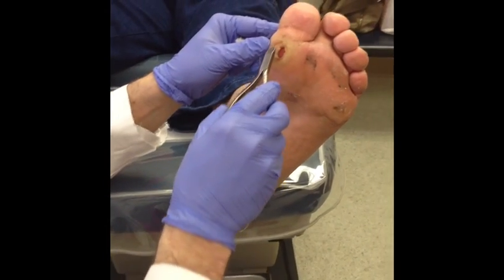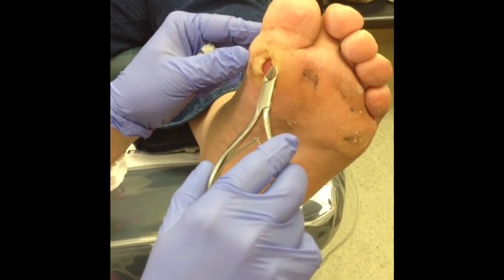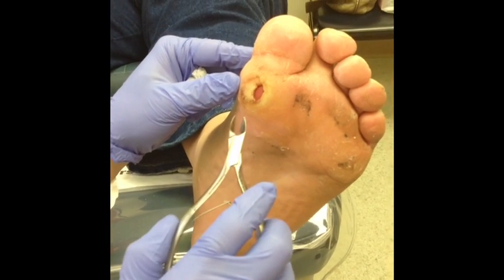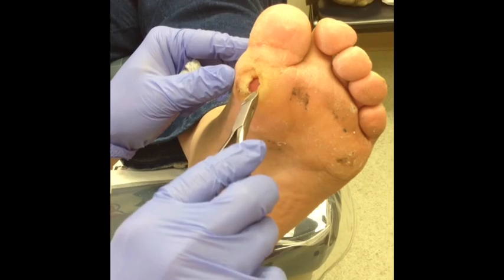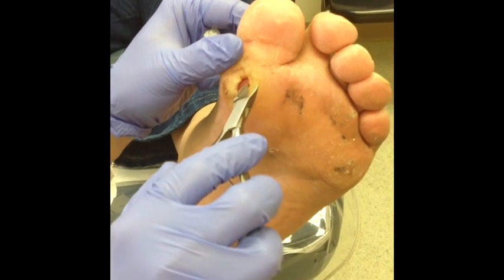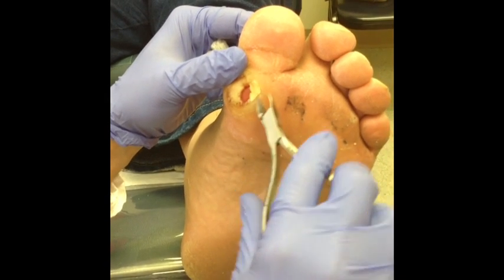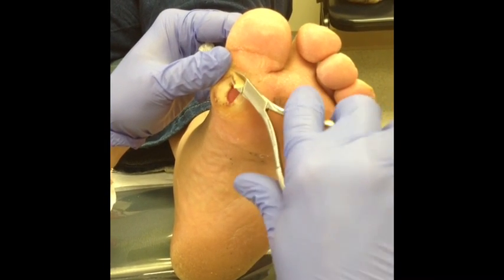You can see around the wound there's this white callus tissue that comes all around it, and that's from the pressure buildup around the bottom of the wound. This is the red, beefy, healthy portion. Every time a patient comes in we actually have to trim off this callus tissue. This is what's important to get a wound to heal — you can't leave this portion on here.